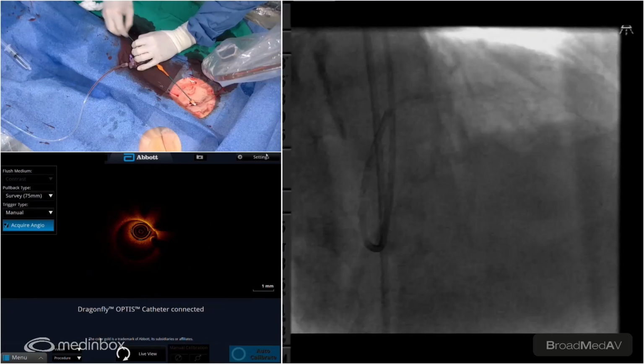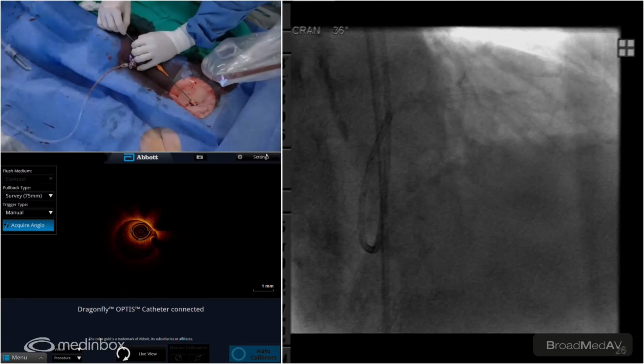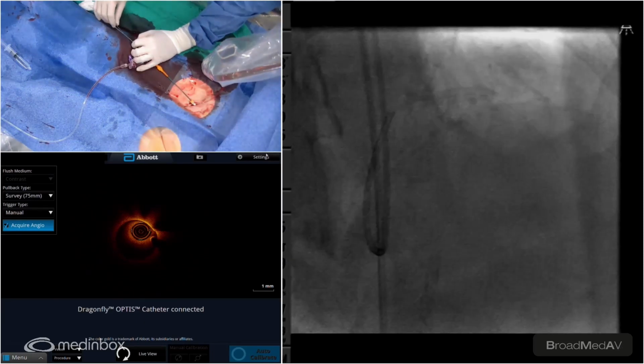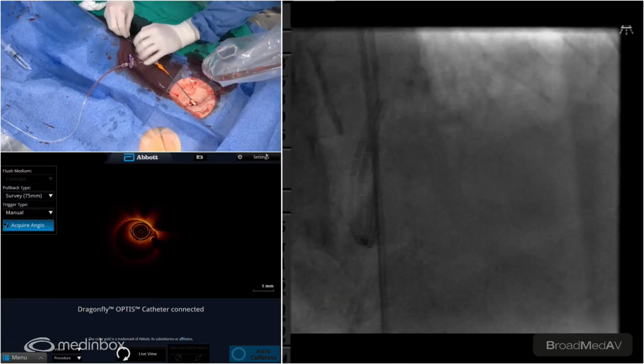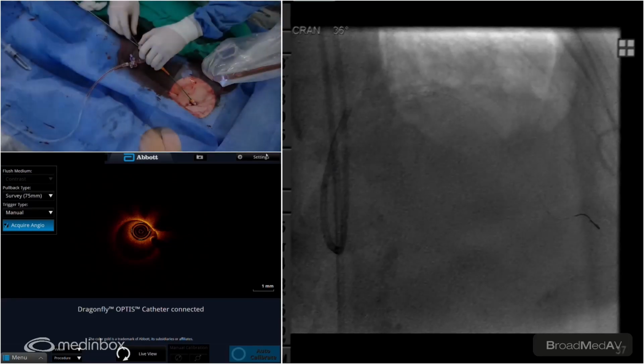Let's go up there. You're going to lose pressure here, Courtney. Up at 12. Yeah, we're up with the trap. I'm going to go with our microcatheter. Yeah, our wire's stable. You just see the distal end of it, so it's not bouncing around. Just let me know when you guys see the wire.